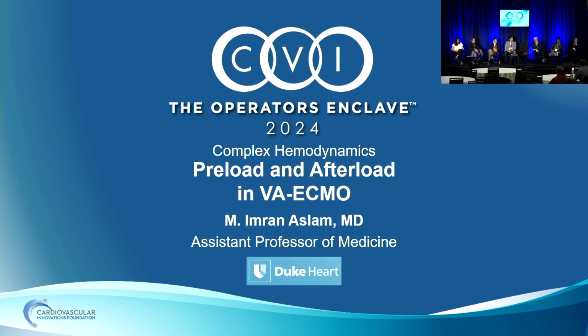Yeah, I think it's a great question. I didn't do the first case. I ended up putting the Impella in and putting the patient on ECMO. But the concern by the initial operator, obviously before DANGER came out, was that we were talking about putting an Impella in these patients when they're under-supported, because the balloon pump, as we all know, for these post-MI patients is frequently not enough. I think here it probably should have gone in initially.